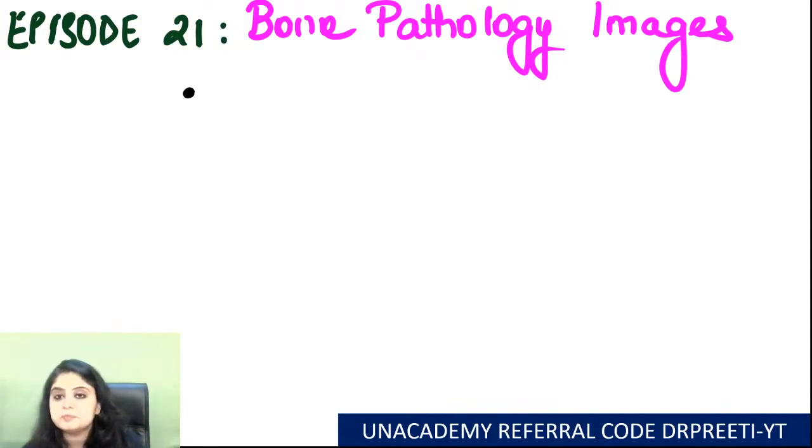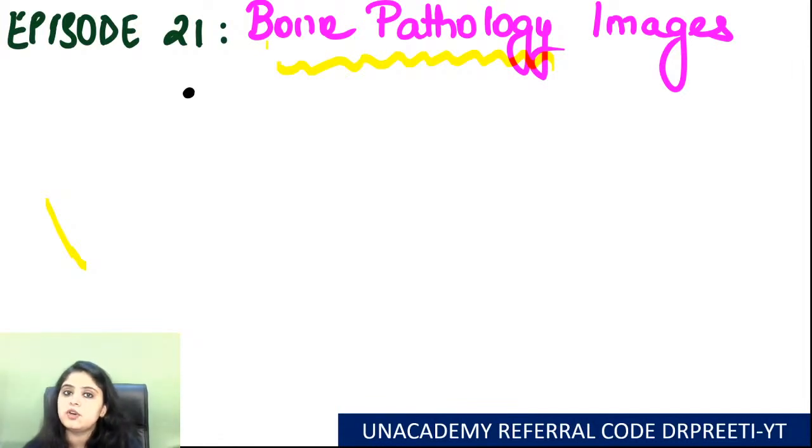So all of you know that Tuesday 8 p.m., as all of you wanted a session on the histopath images of the bone tumors. So yes, that is what we are going to discuss today. A topic which we don't usually touch upon, but somewhere you must have seen that in all your entrance exams, one question here or there does sneak in from bone pathology histopath image. So today we are going to sort the same.